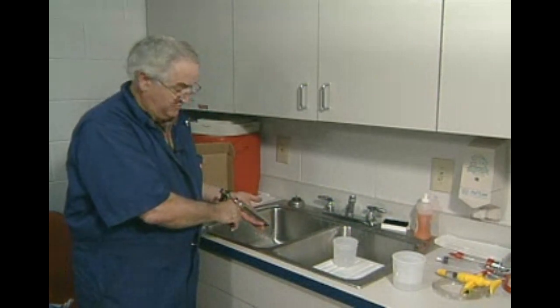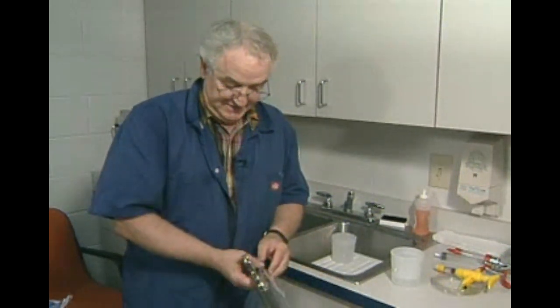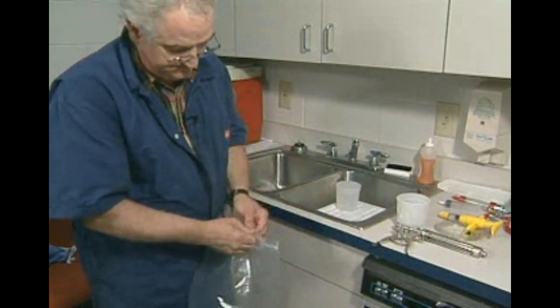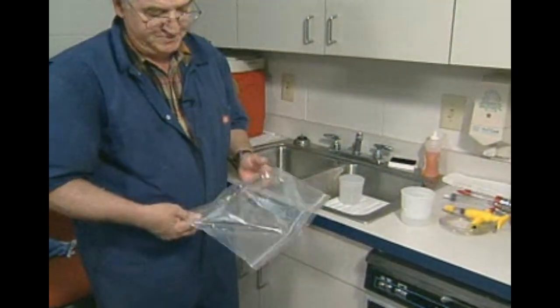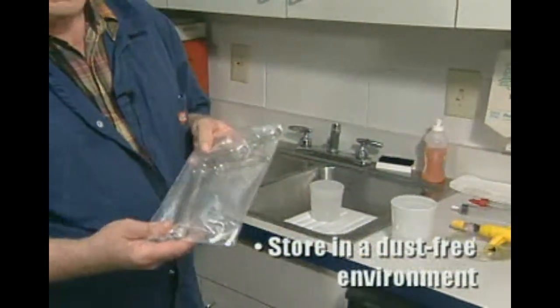After the cleaning, we now have one final sanitizing step that allows us to store the syringe in a clean bag, such as a zip-lock. These should be stored in a dust-free environment, and one of our favorite places around feed yards is literally to put them in the freezer.